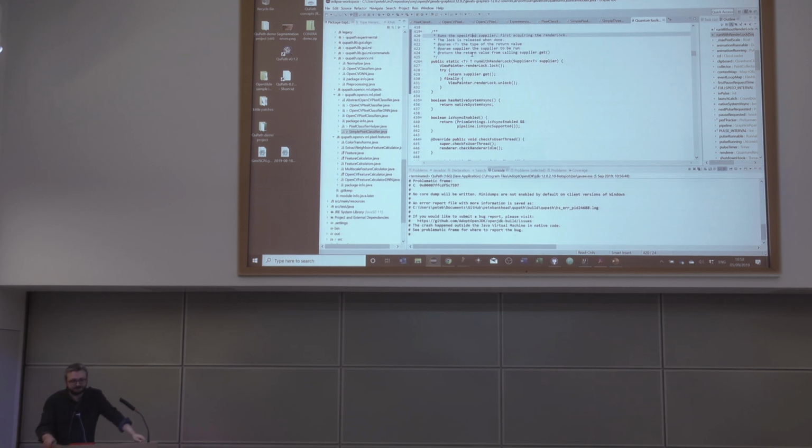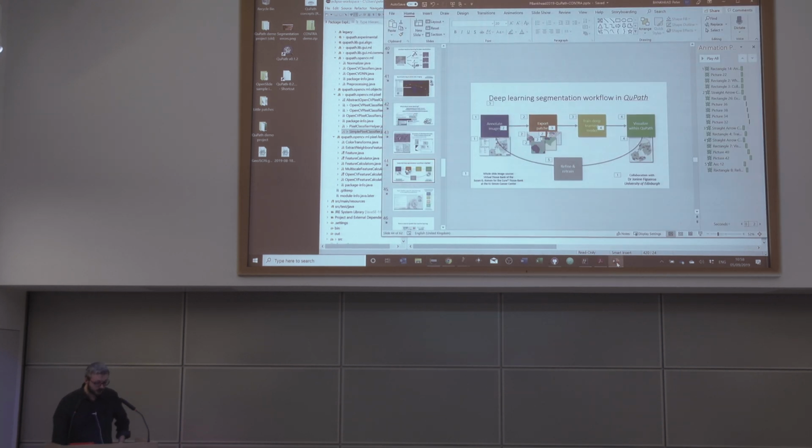And the other one was just, obviously, when you're coding, it's useful to have examples and things. Do you have many examples? In terms of the deep learning, not really any, because as you can see, it's very much a work in progress. It did generate this image. It has worked in the past.